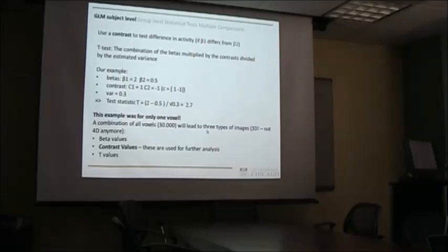This also means that, for example, if you look at your images from your data, these type of statistical images are a lot smaller than your raw MRI EPI images, just because they contain a lot less data. So there's quite a bit of data reduction that happens in this whole process of model testing.